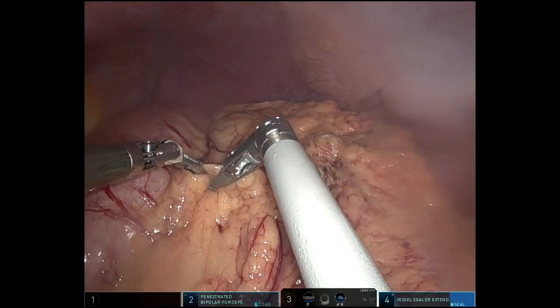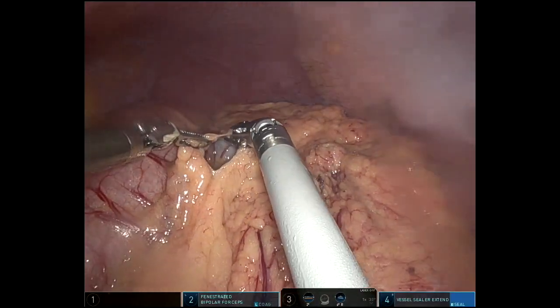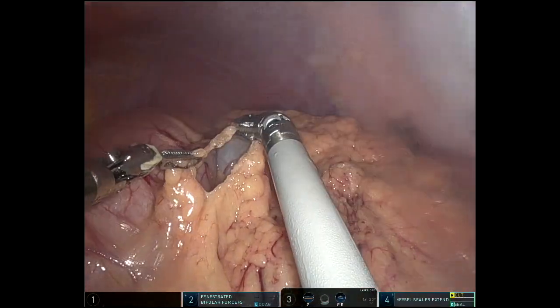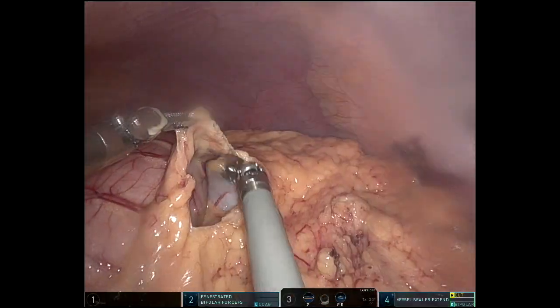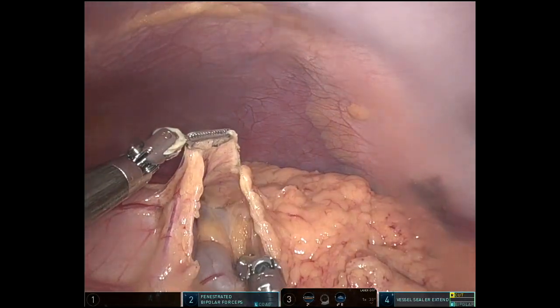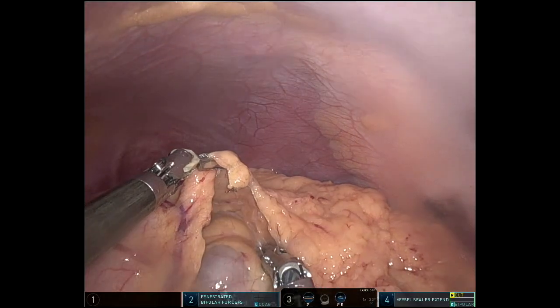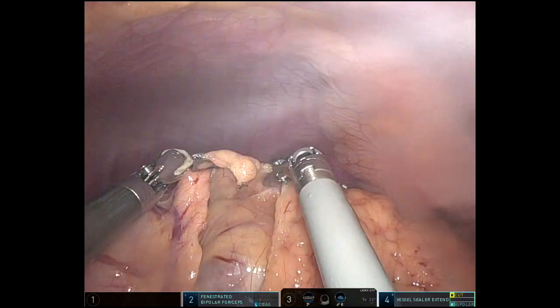I did have to use table motion in this case, which is just wonderful. Now that we have two Xi robots, I can do that in whichever room I'm in. I didn't put her in any reverse Trendelenburg — I just basically leveled out the bed a bit, not even all the way.